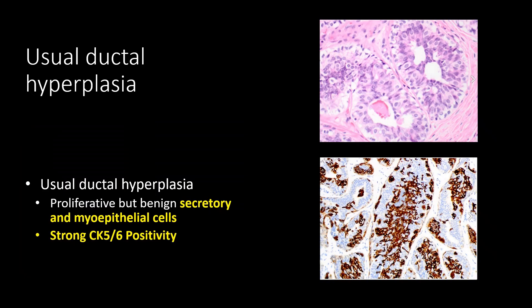Usual ductal hyperplasia is a proliferation of benign secretory and myoepithelial cells. You can see that this layer is becoming a little more thick, but we're still preserving the layer of myoepithelial cells. For that reason, there's going to be strong CK5/6 positivity, which is a stain used to identify those myoepithelial cells.